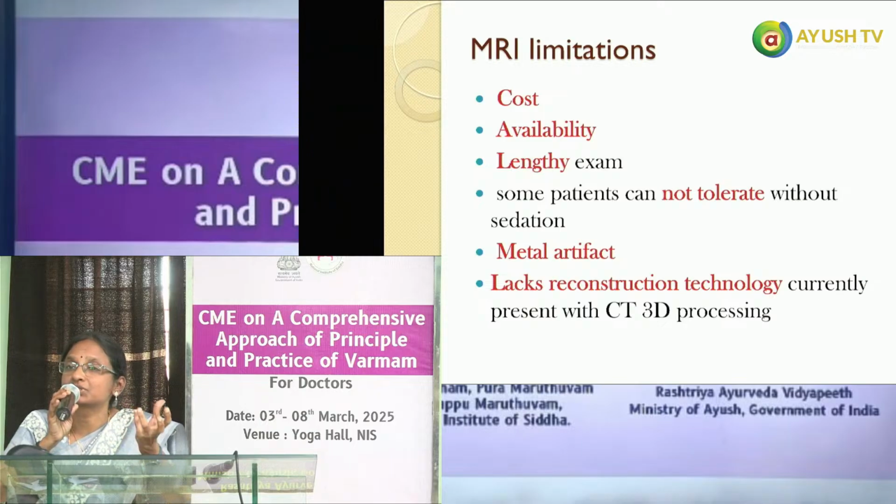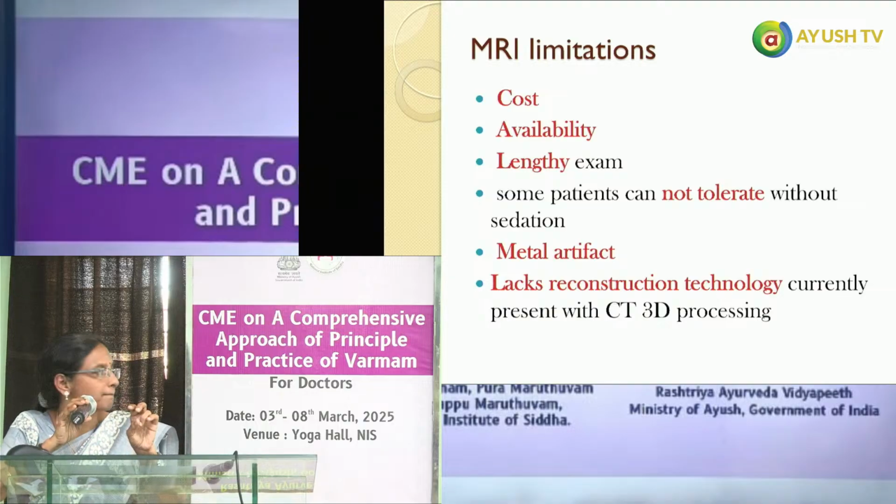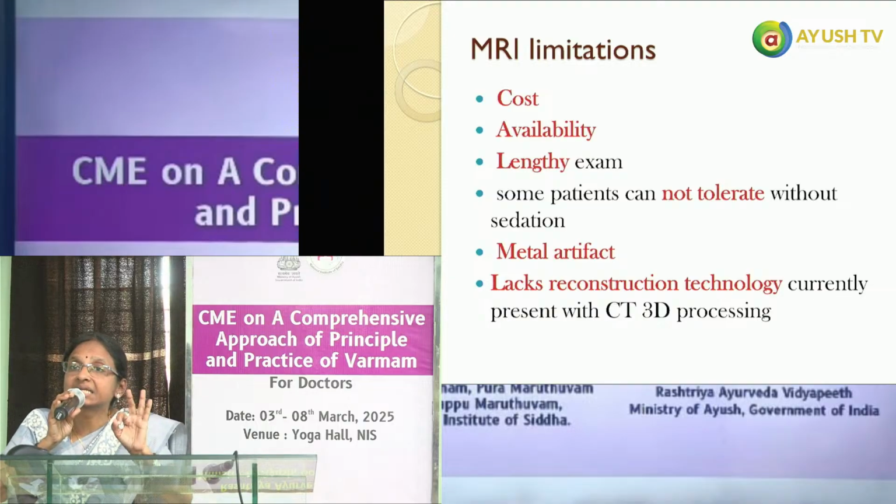Metal artifacts: because it is a strong magnetic field, if there are pacemakers, implants, or any such metal present, then this investigation has to be avoided. And the 3D reconstruction is not as good as with the CT scan; you will not get that with the MRI scan.